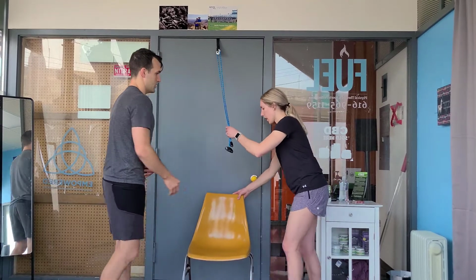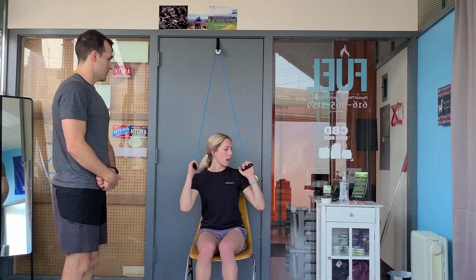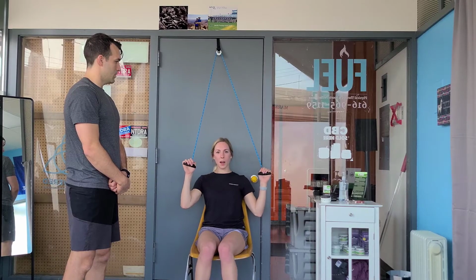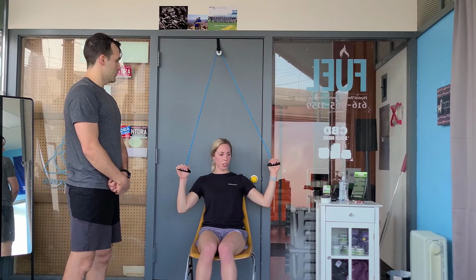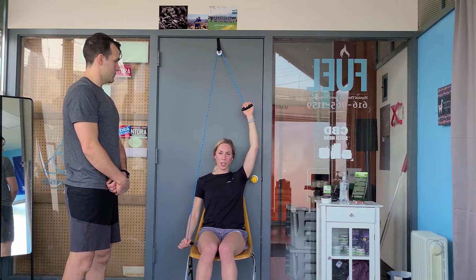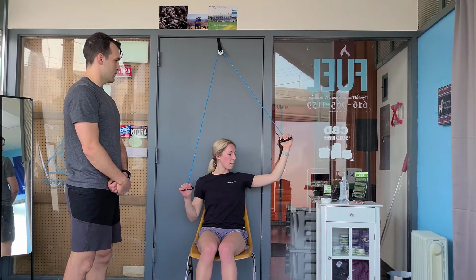Yep. And I'm going to sit going down to the side, so I've got more full range of motion. So with out to the side, we would want to make sure that that thumb is up. And so I'm going to use my left arm, which is going to be more like the surgical side or the injured side. So I'm using my right hand to let my left one just kind of go for the ride. Holding at the top about 3 seconds or so, and then nice and easy coming back down.